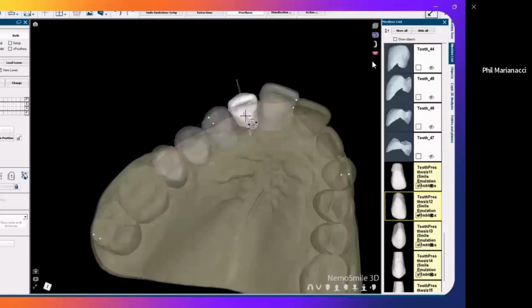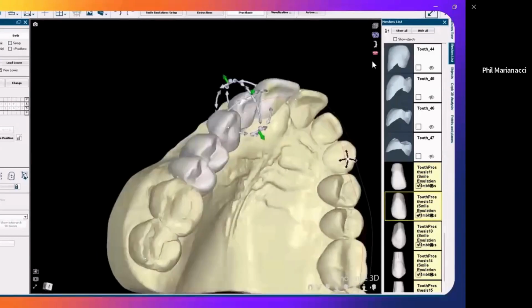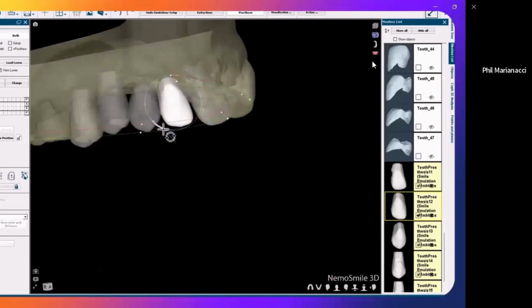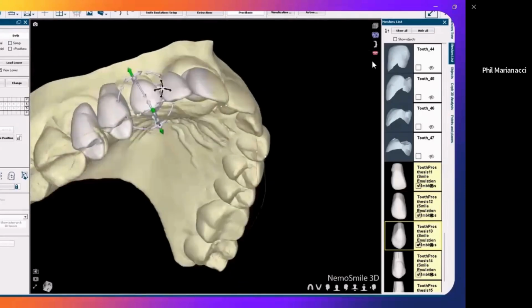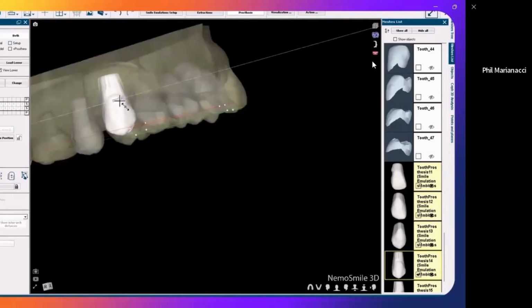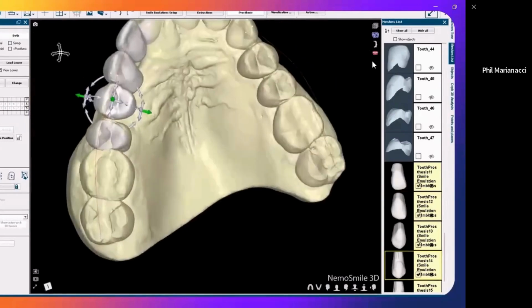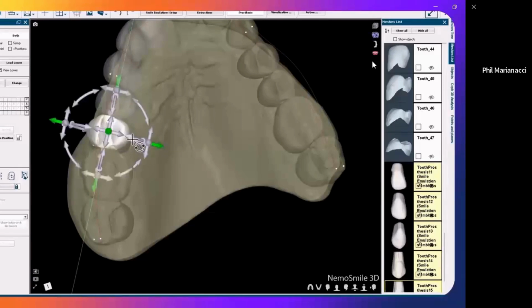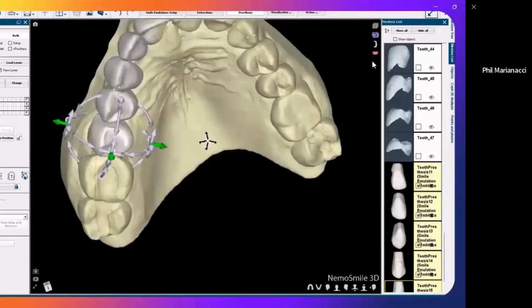Again, one of the things that these start to make you look at are some of the tooth rotations that exist on the opposite side. And also, I think there has to be some kind of acknowledgement or discussion about should those be corrected orthodontically, or are we just going to more or less keep things as is and just fill in the space. And that's the multidisciplinary team aspect to it. I don't think there's any right or wrong, but the important thing is to at least have the conversation and to document it with the patient, so that it doesn't become a point of discussion after the fact.